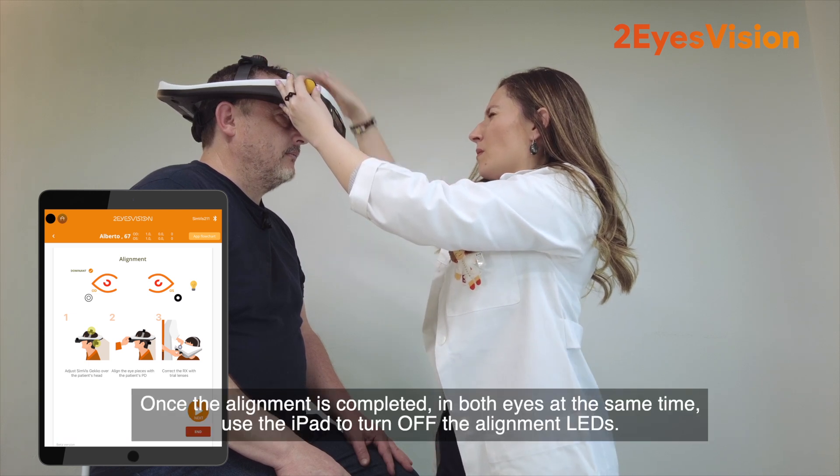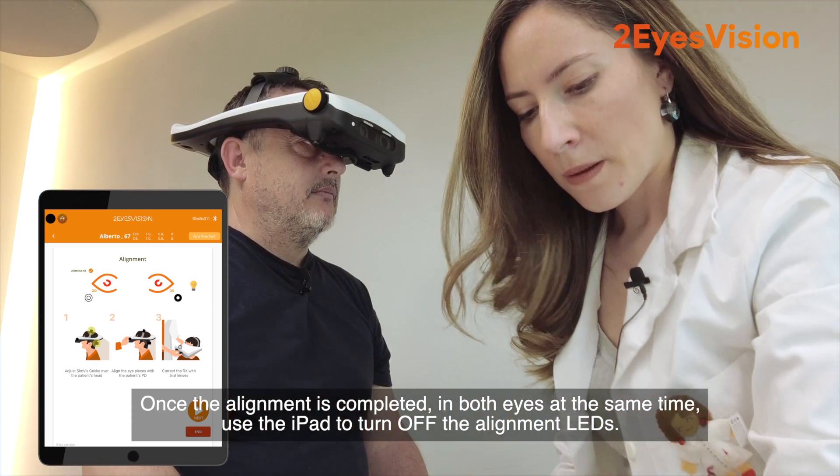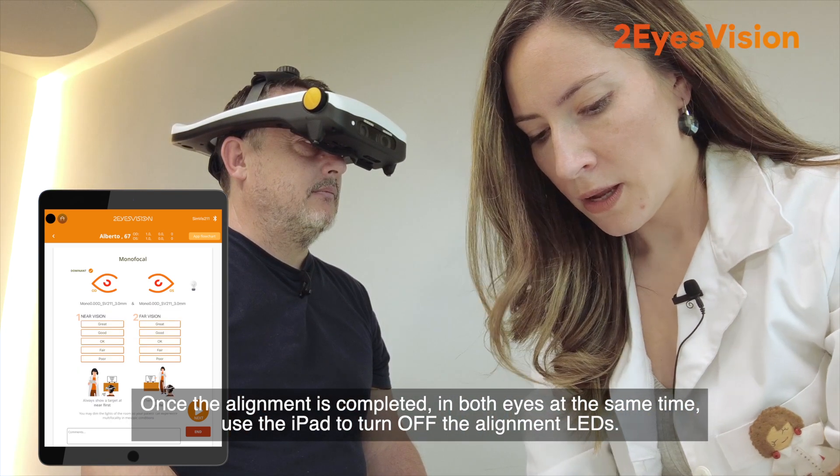Once the alignment is completed in both eyes at the same time, use the iPad to turn off the alignment LEDs.